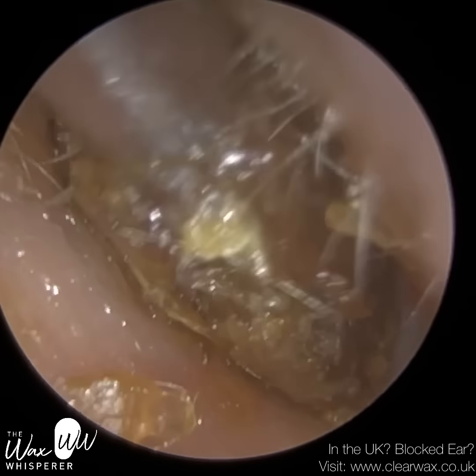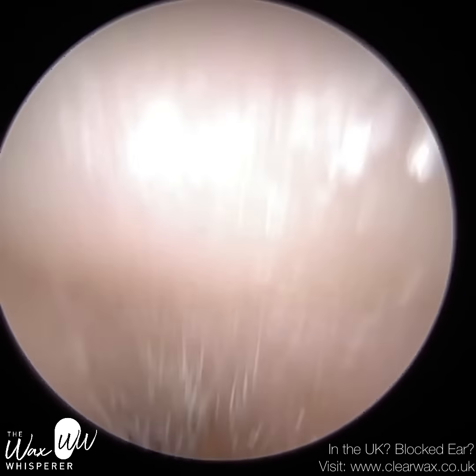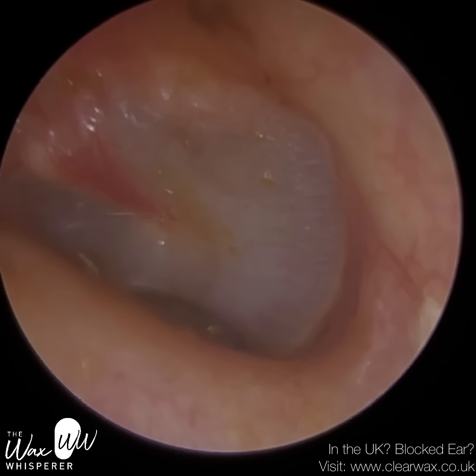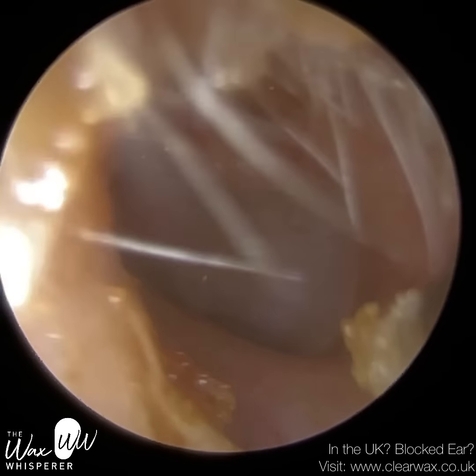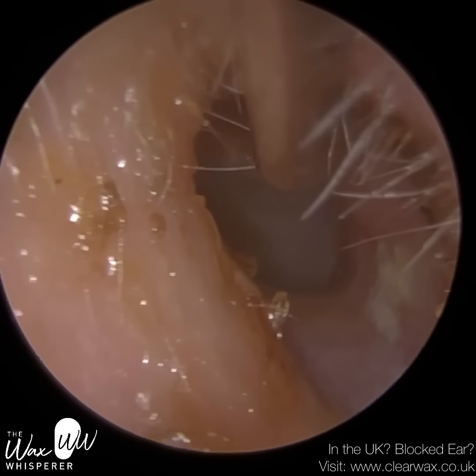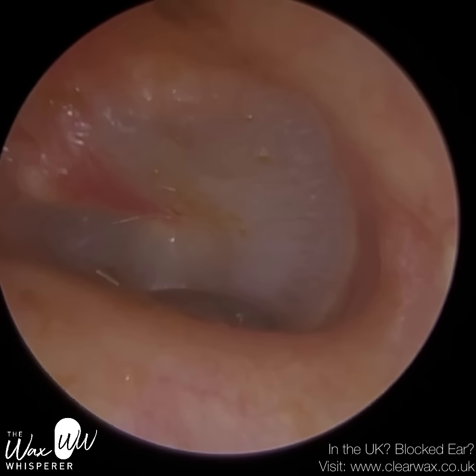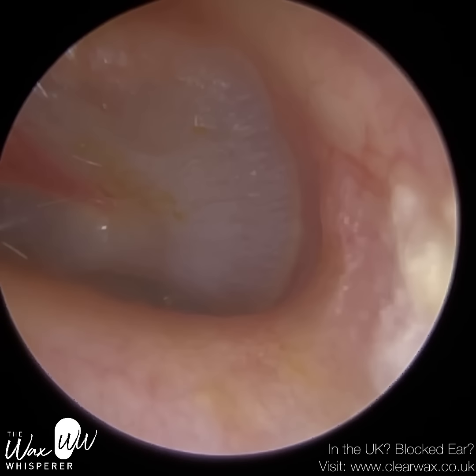There appeared to be a bit of wax still stuck on the front part of the ear canal near the eardrum — what we call the anterior medial canal wall. But under close inspection, I went in with the suction probe and it's actually some bruising. I asked the patient whether they'd been poking in their ears, and they said yes. The wax got really squashed and caused a bit of trauma to the side of the ear canal wall. It was difficult to decipher whether it was wax or bruising. Fortunately I withdrew the suction probe, because if I had touched that bruising, it would have been really uncomfortable and they might have flinched — and I might have perforated the eardrum.